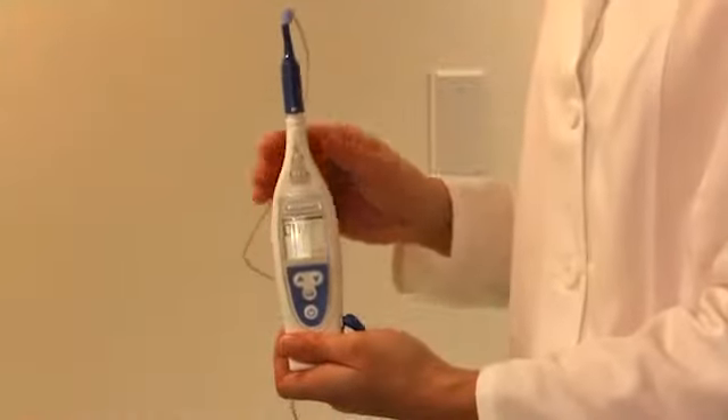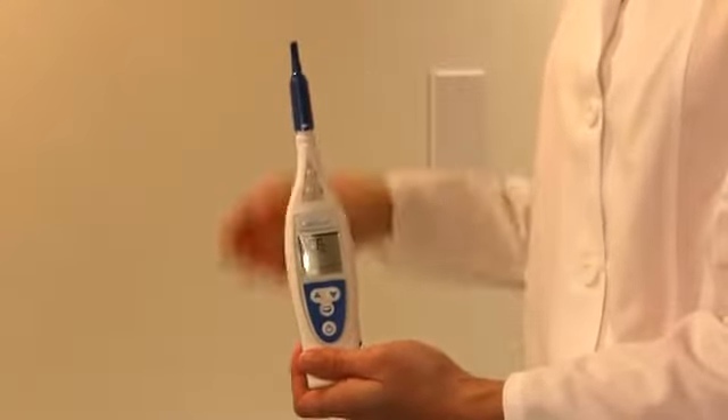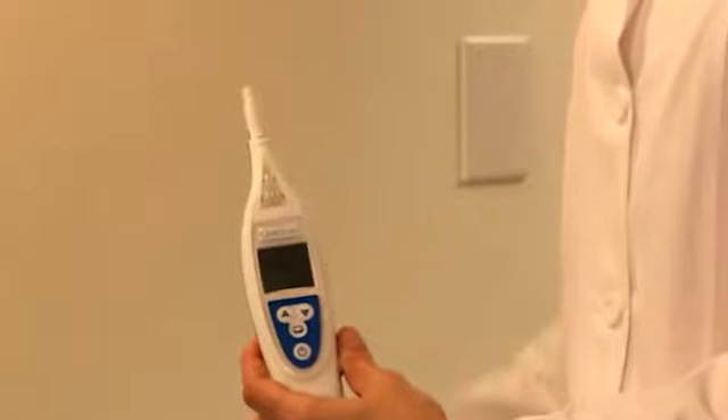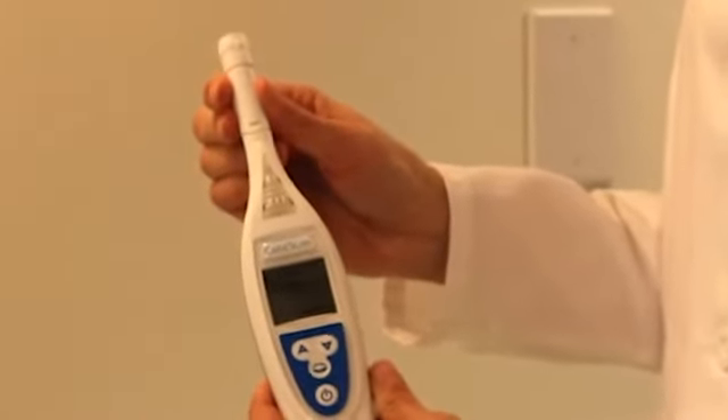Once the test is complete, remove the cable from the test sensor at the top, then remove the test sensor and place it back in the box. Now attach the white collar by inserting the device into the collar until it clicks.